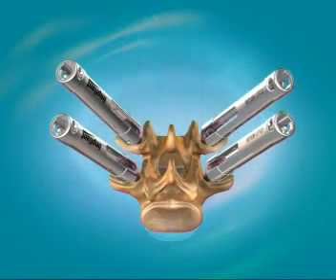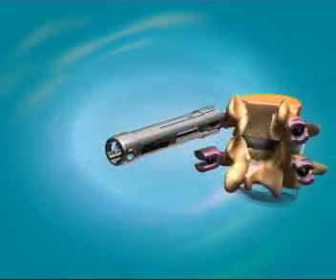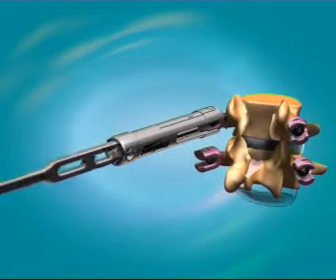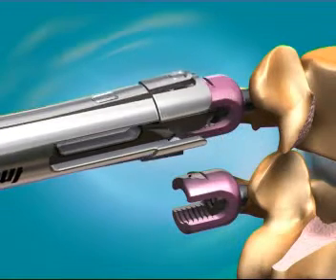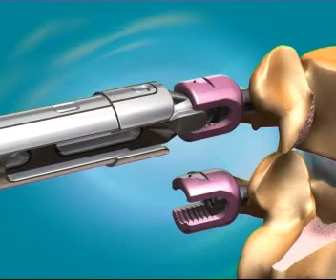You can mount or dismount the extenders during the operation. If you want to remove one or more of the screw guides, insert the screw finder into the pedicle screw guide until it stops. Slide the guide upward until it releases from the pedicle screw.